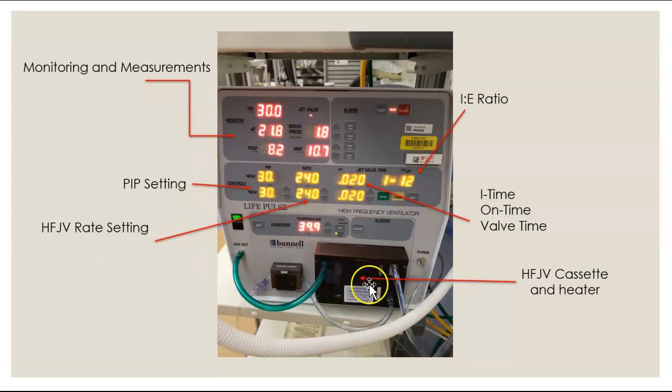And this will literally, you'll sit it in, close this, and then this flap closes on top. This water pump pinches here and will deliver water as needed. This is the jet heater. For this circuit, it will be set at 40 degrees, which you can go up and down here. Normally, it's just set standard 40 degrees. And you can silence because it will alarm.